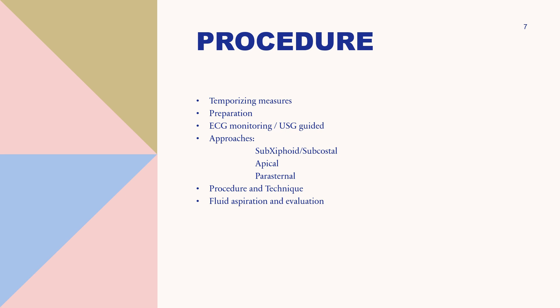Repeating the ultrasound examination at 24 hours is recommended. Diagnostic evaluation of non-hemorrhagic fluid is similar to that of pleural fluid. Suture the pigtail catheter to the skin, being careful not to occlude the catheter by tying it too tightly. Wrap the catheter in gauze at the skin, cover it with sterile dressing, and attach the catheter to suction tubing and drainage system.